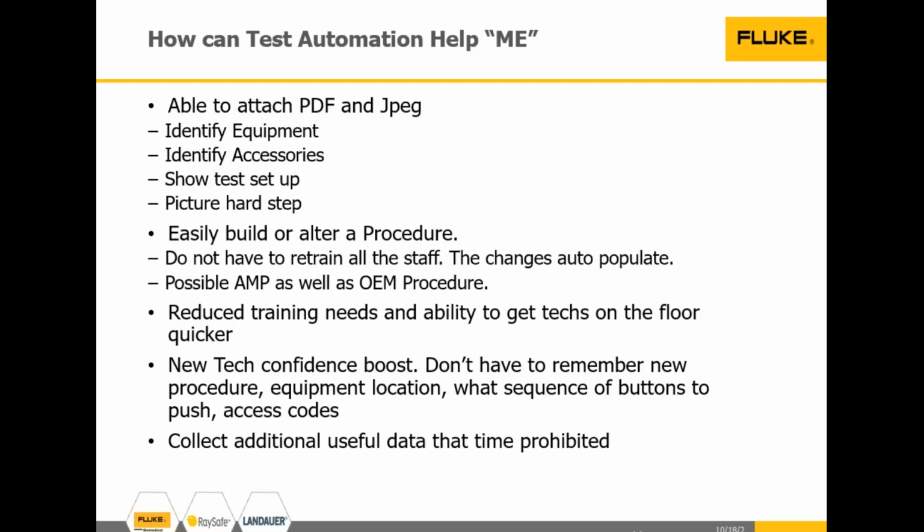Then, if you have an alternative maintenance program, maybe you want another PM procedure that's scaled down because you don't need all these steps. You have evidence that this monitor doesn't break, so instead of having to do 50 steps, you figured out that you only need 6 steps, right? So that's the second level PM. But then, when it does break, when it does fall off the top of the anesthesia machine and gets drop tested for the 13th time that day, and it goes down to the shop for repair, you can't use your alternative maintenance program anymore, can you? You have to have another PM procedure, the OEM PM procedure.